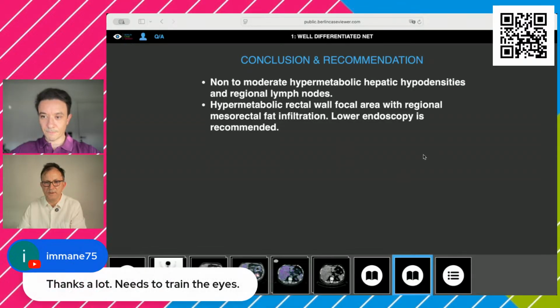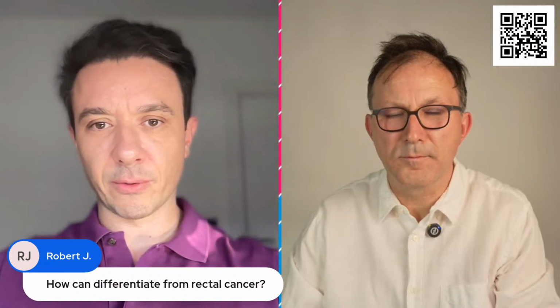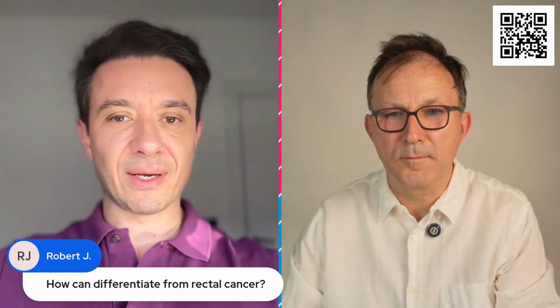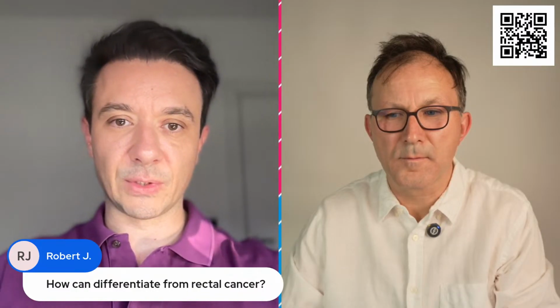Very nice. So you get immediate feedback here. And another question came in. How do we differentiate this NET from rectal cancer? You can't. You need histopathology. I can't differentiate neuroendocrine tumors from adenocarcinoma. You need histopathology. But in this case, the liver lesions, you can say they're a bit typical for neuroendocrine tumor metastasis, and they were not showing uptake. So the first thing I thought of was actually neuroendocrine tumor.